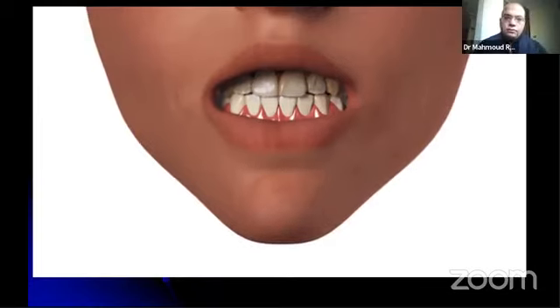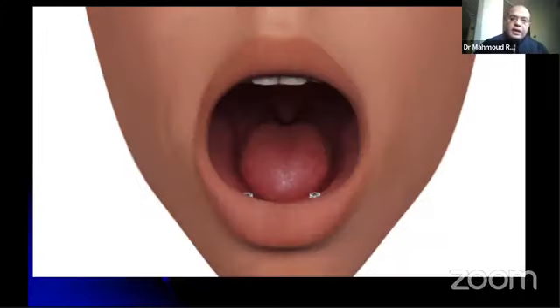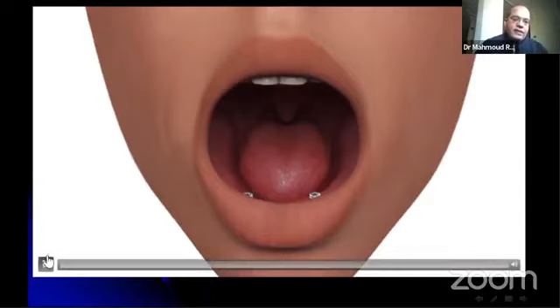If the denture has too much or too little retention, you can change the plastic cap. If you see that your patient has too much retention or weak retention, you can change it by using another cap with the desired retention. Here we see a form of the locator.